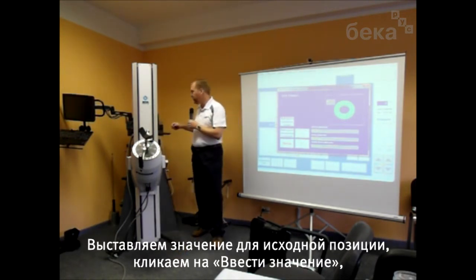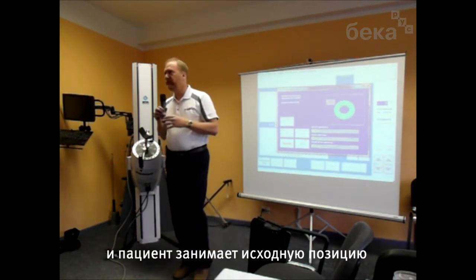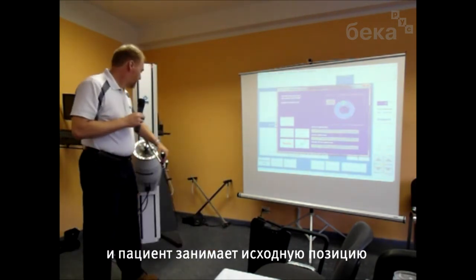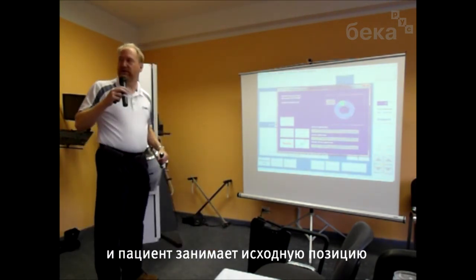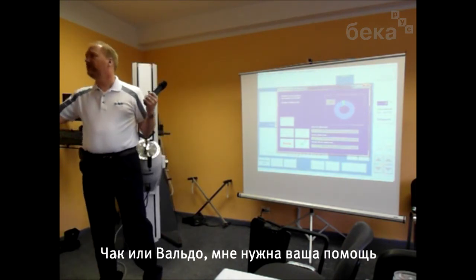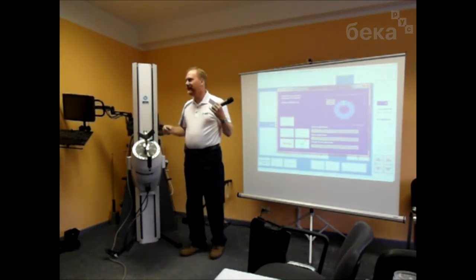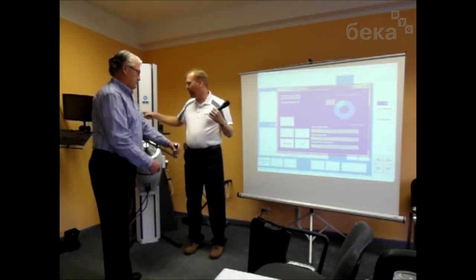So to set the start position, just click on Set Start, and then have the person move to the start position. Actually, Chuck or Waldo, either one, if you wouldn't mind. It's just a lot easier. Yeah, that's what I thought. Yeah. If I was doing it with that.